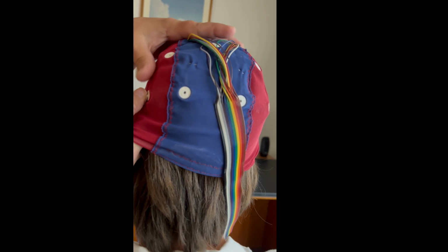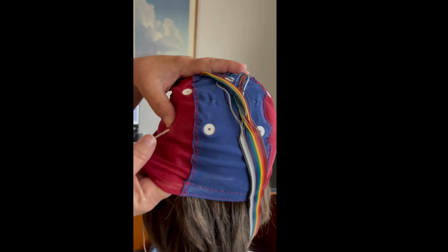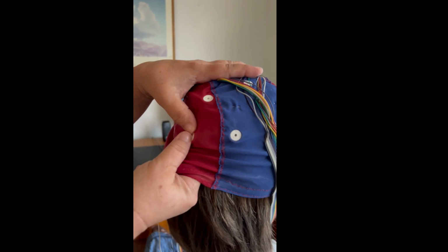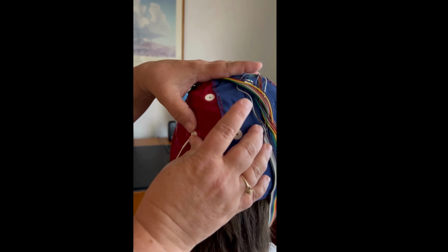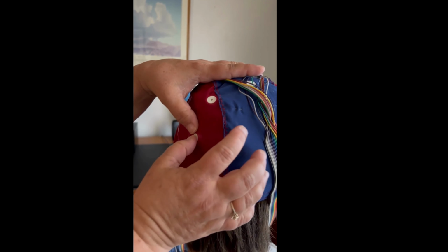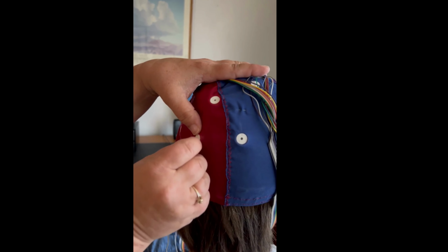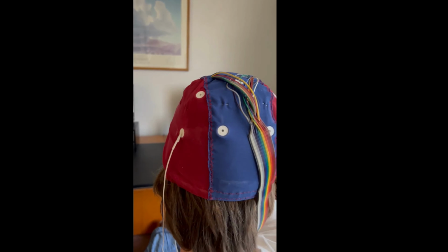There's a big, kind of a clump of hair. And that happens sometimes when you put the cap on, especially with people with long hair, kind of pushes the hair together, especially on the bottom part of the cap. So, there we go.